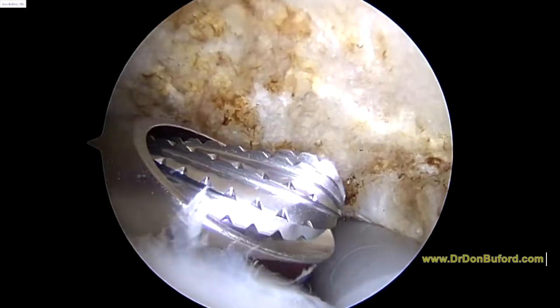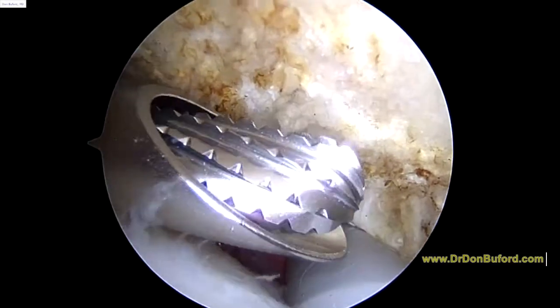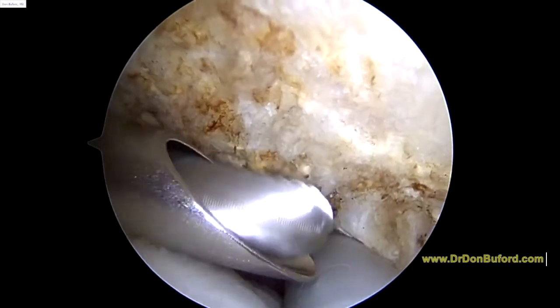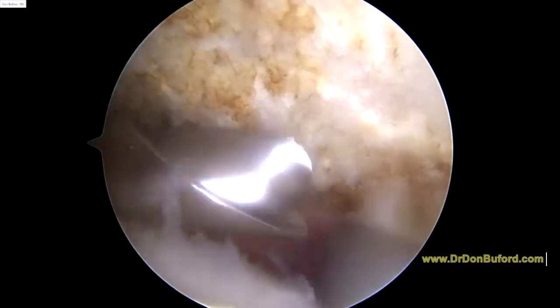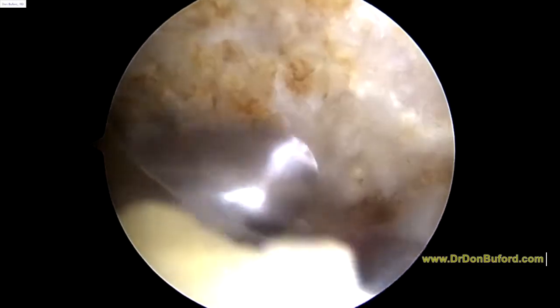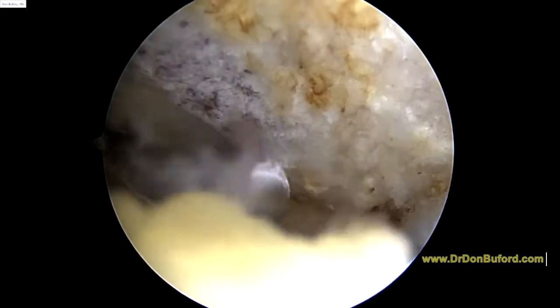This instrument is what we use to remove the bone. This is called a burr. See, it's got a sheath on it, and then when I hit the button, it spins real fast like that. And when we touch it to the bone, we're able to just gently remove bone millimeter by millimeter as much as we want.